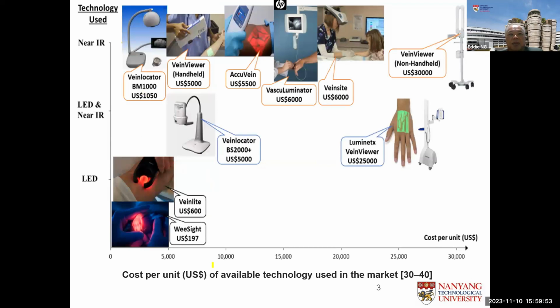Here is a comparison of the current vein viewer devices versus cost. You can see that some vein viewers using the near infrared approach are very expensive. So we are aiming for low cost and yet reliable, using just an infrared camera without any light source.